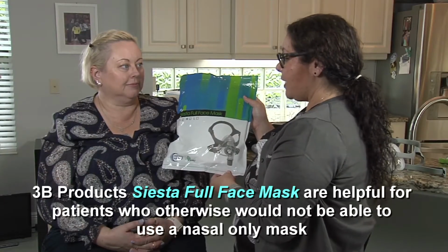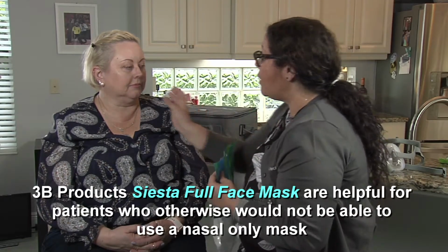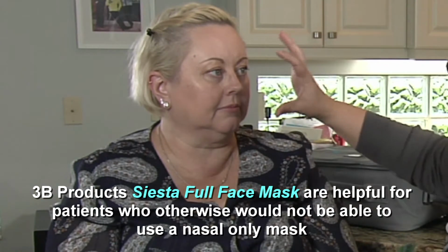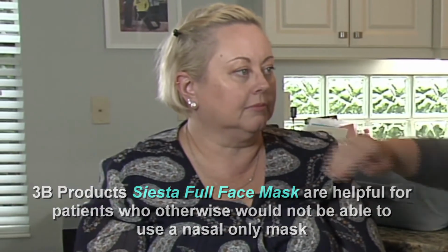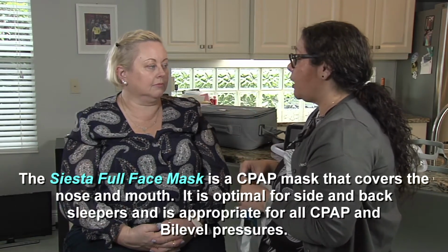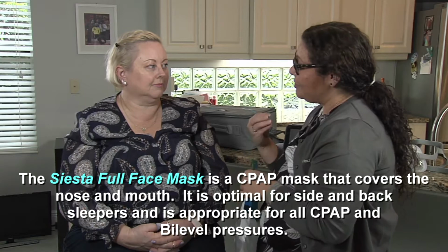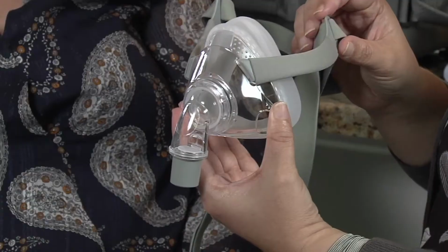Full face mask sizing is very dependent on the width of your mouth and the length of your face between the bridge of your nose and the bottom of your bottom lip. We don't want a mask to be too large because air will leak into your eyes. And we don't want the mask to be too small because then the edge of your mouth can come out of the cushion and air will leak out of your mouth.